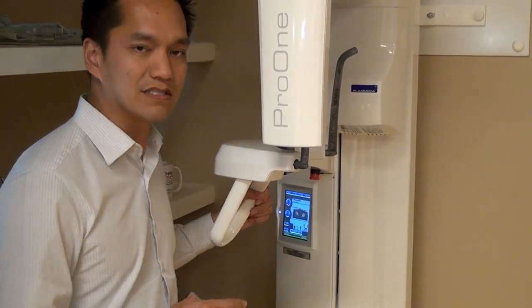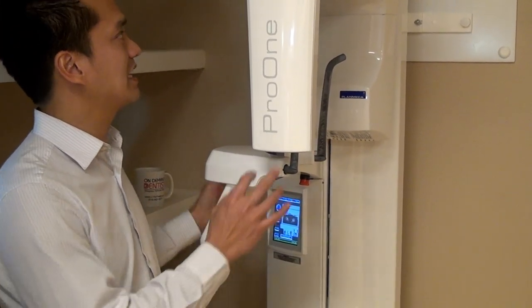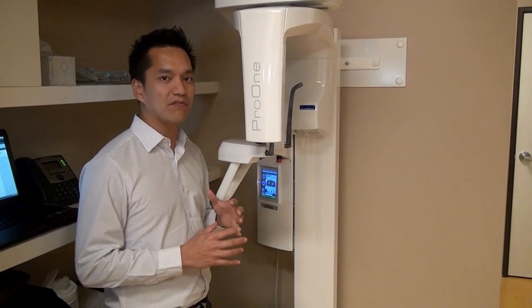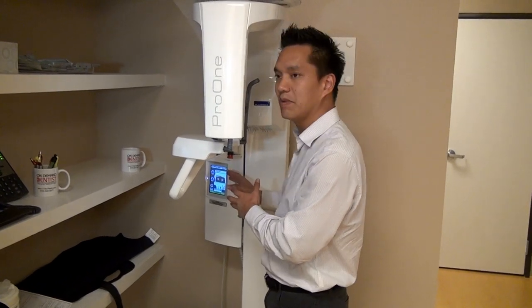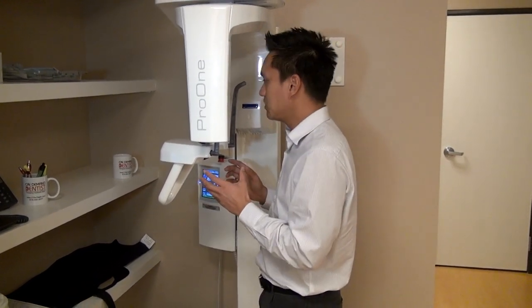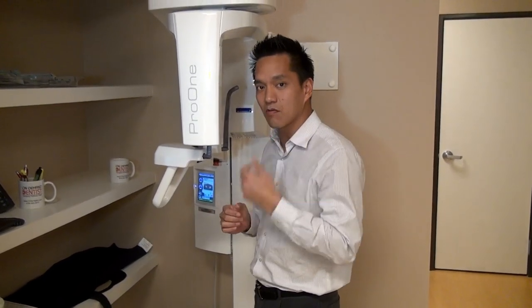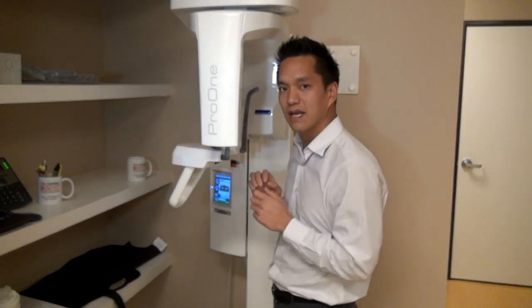This particular edition also has the software to do extra-oral bitewing X-rays. The way it works is that it shifts so that the X-rays come in at a 90-degree angle from the opposite side, so it can get right through the contacts. What we do is get our patients in here, line them up, do the panoramic X-ray, and then reverse it — we tell them to hold really still. Then we go on the computer, change it to the bitewing, it makes a little shift, we line it up, put the laser beam right here in the middle of the lateral incisor, close the temple guards, and press it again.